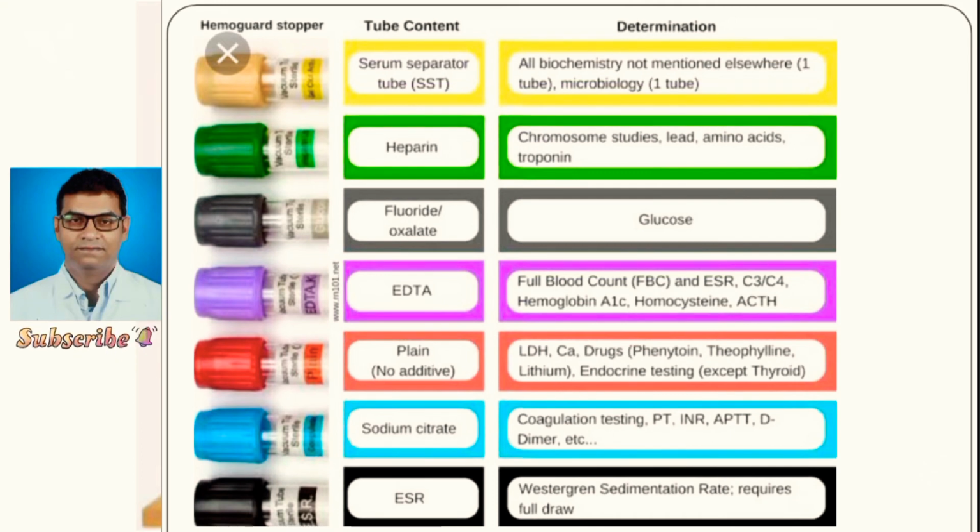Heparin is the preferred anticoagulant for the osmotic fragility test. Heparin is also used in capillary tubes for spun hematocrit. Heparin covers the entire capillary tube glass. These capillary tubes are also called microhematocrit capillary tubes. Heparin is also used in LE cell preparation, lupus erythematosus. Heparin is found in basophils and mast cell granules. Heparin is used therapeutically as an in vivo anticoagulant.